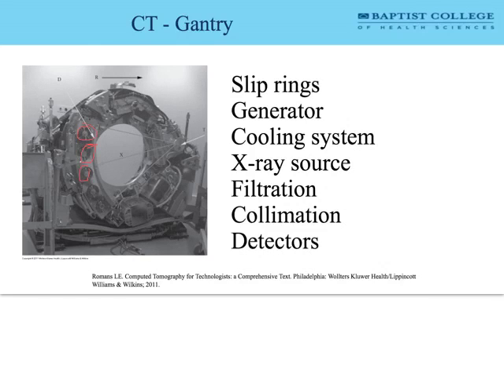I'm literally reading right out of the book right now. These are important basic principles we should understand about these detectors: the smaller these apertures are, the better the spatial resolution will be, and the better it will get rid of scatter. It basically almost functions like a grid in X-ray.